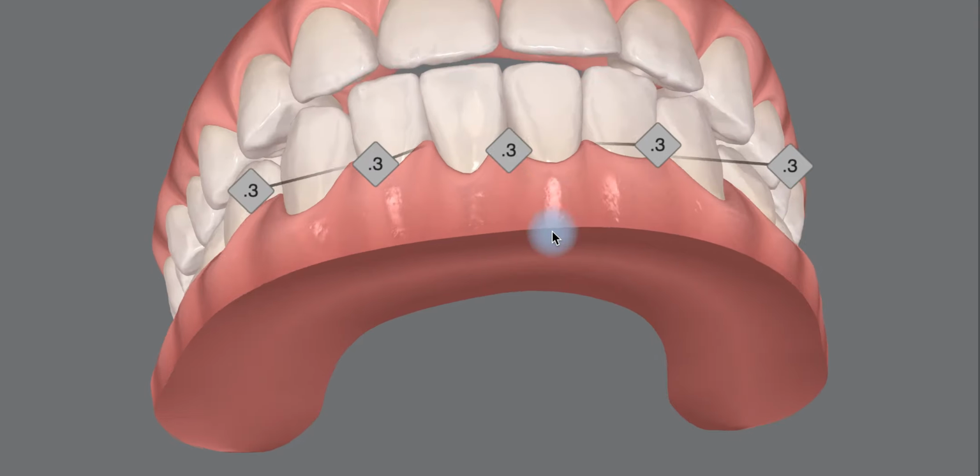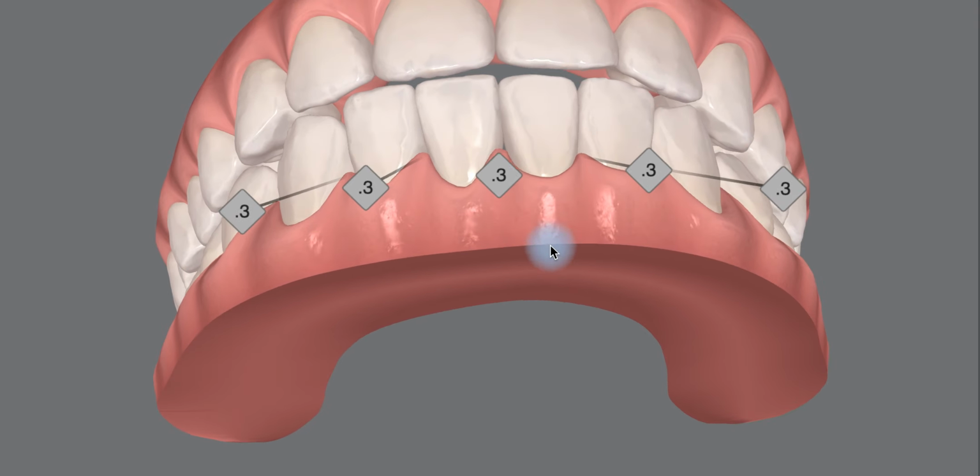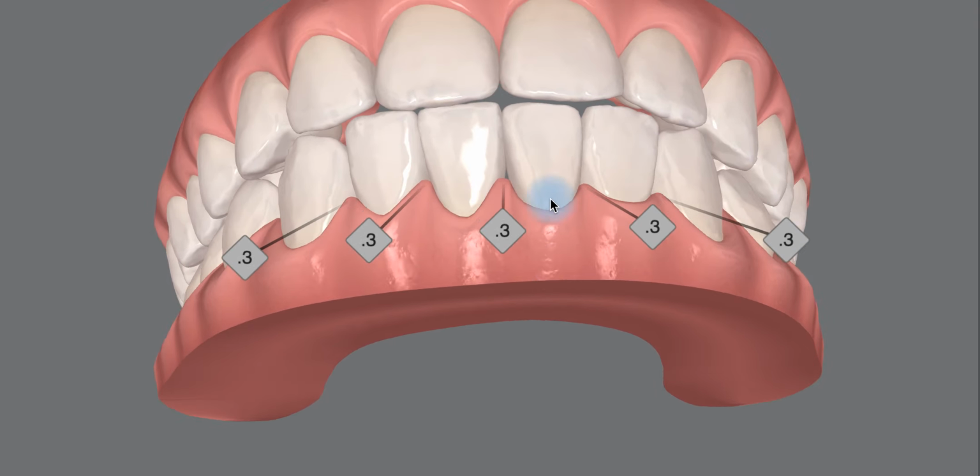So this is how I'd recommend building this in, is about that much overjet. And then you see the patient frequently. Once they get edge to edge, you just see the patient once a month, and then you stop them when you're happy. And then you can kind of fine tune everything from there.